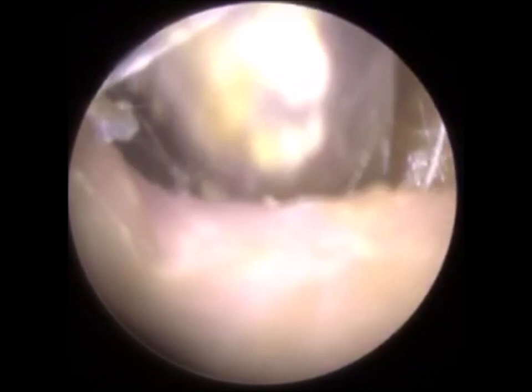There we are. I've got a better grip here, but again, it just doesn't want to come out. It's stuck. As I said, it's like a piece of chewing gum. Can just see that plug now. It's beginning to loosen. I think I got, well, it just sliced again. And that's why with forceps, quite often people say, well, why didn't you just use forceps straight away?